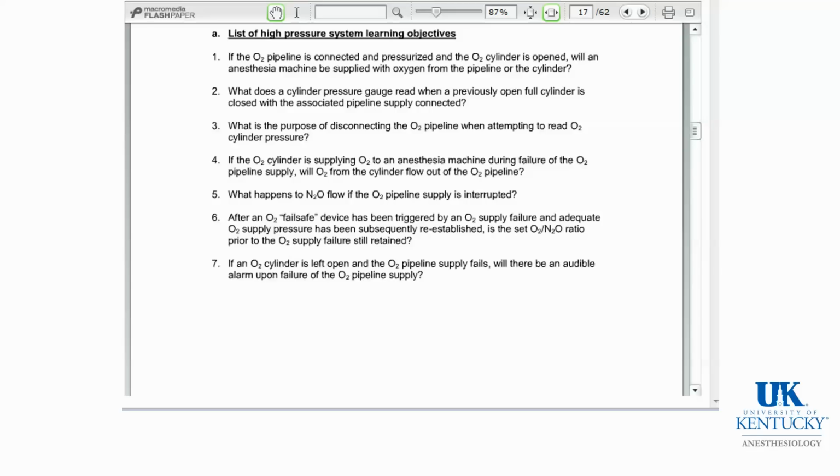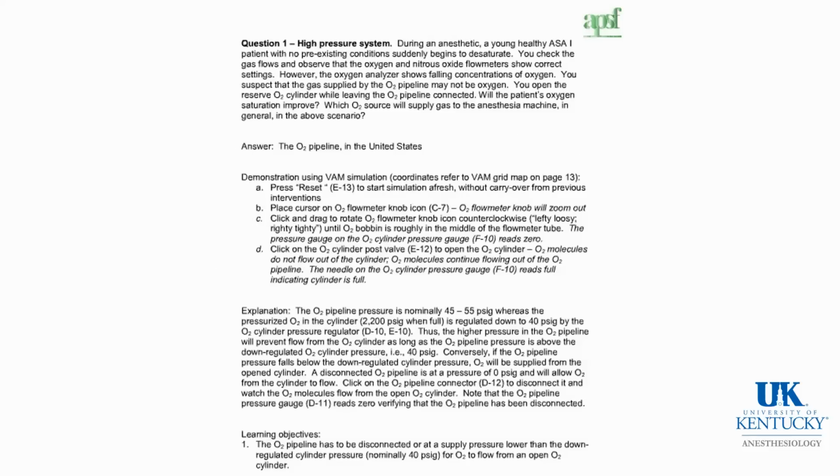This list of high pressure system learning objectives is asking a similar or identical question. If the O2 pipeline is connected and pressurized and the O2 cylinder is opened, will an anesthesia machine be supplied with oxygen from the pipeline or the cylinder?